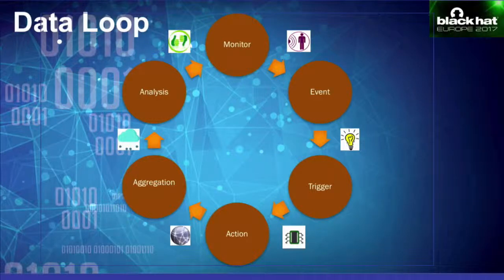That data is then passed on to something called an event architecture. What the event architecture module does is constantly analyze that data, and if it sees a deviation from normality, it can trigger an alert, and using the on-chip board, that can create an action. The action could be injecting the appropriate amount of insulin into a human's body.